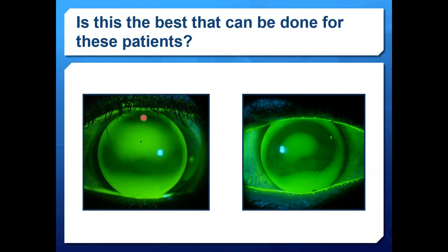For instance, we take this patient that has a high elevation in their corneal surface, then a low elevation where we get this bubble, then again the high elevation, and then again a low elevation. So this eye has so much asymmetry running through the vertical meridian. And what contact lens do we have available to us that allows us to fit that kind of shape?